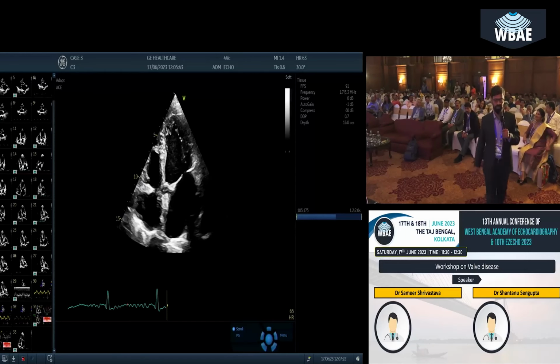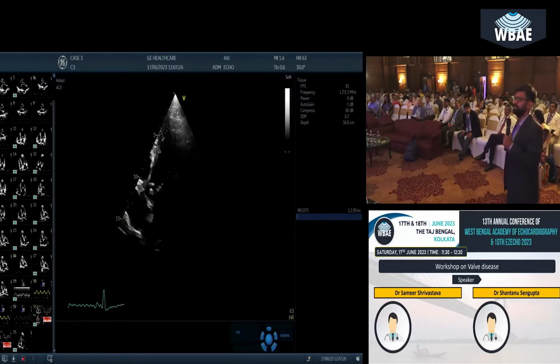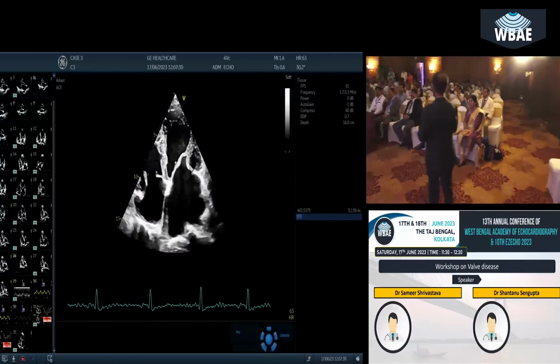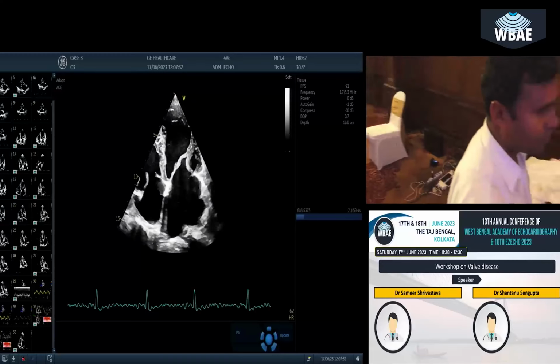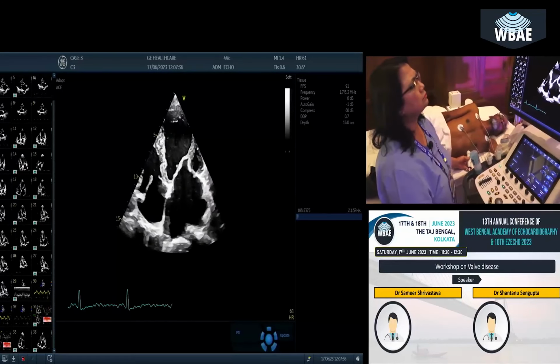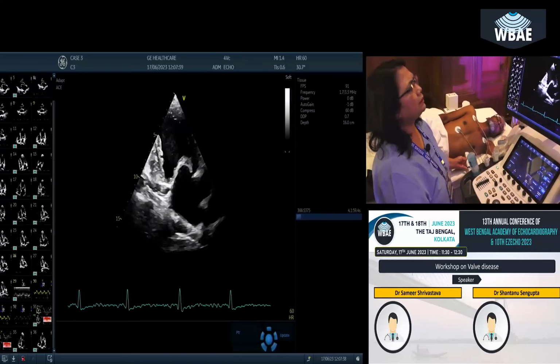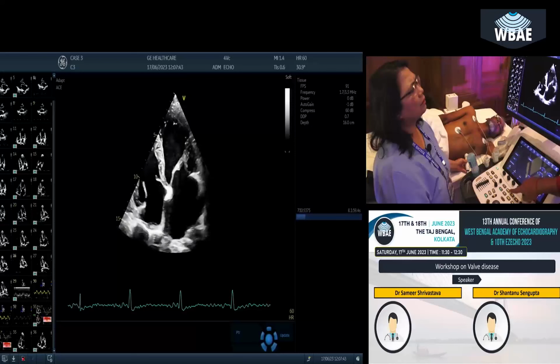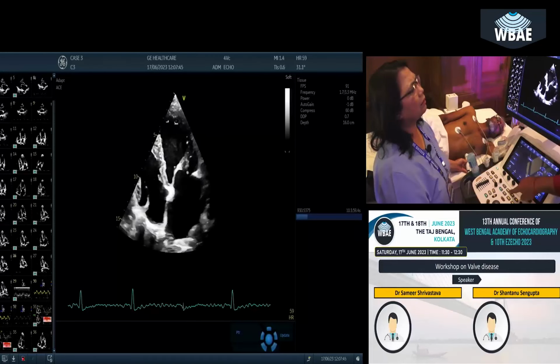So we'll do 4-chamber view, LA focus view. Madhu, record 4-chamber and 2-chamber, and then we'll do offline LA volume quickly. The machine knows the formula; you should know the formula. It is 0.85 into area 1 in 4-chamber view, area 2 in 2-chamber view, divided by the smaller L, and we index it to body surface area. So you take an LA focus view.